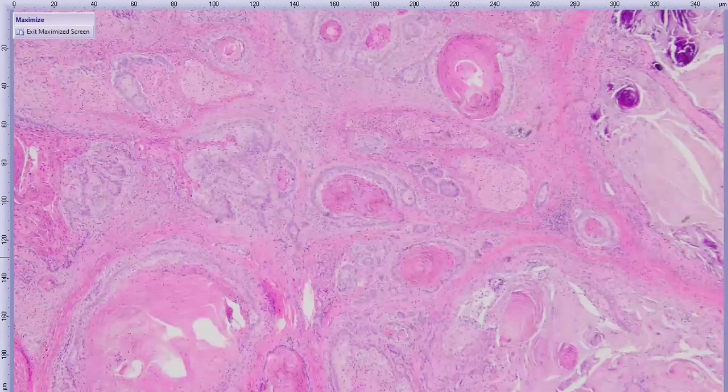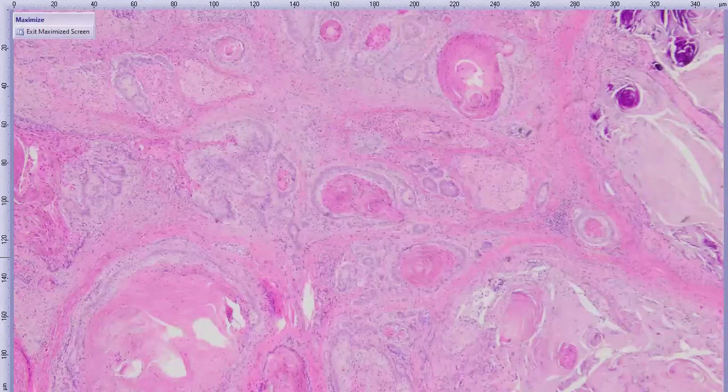So ocular surface, especially lateral ocular surface, and third eyelid, especially the leading edge of the third eyelid, are exposed sites where you might get solar-induced tumors. But there are certainly also other ways for squamous cell carcinoma to form. It's not always a solar-induced tumor. But that would be the suspicion in this case.